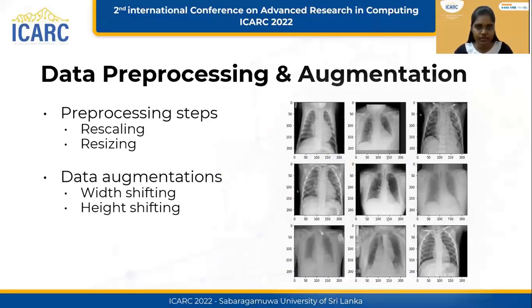Data pre-processing is performed to transform different images to a consistent setting. All the images are resized to the same size and then normalized. Augmentation is used on the training set to generalize the images, using width shift and height shift with a range of 0.1.